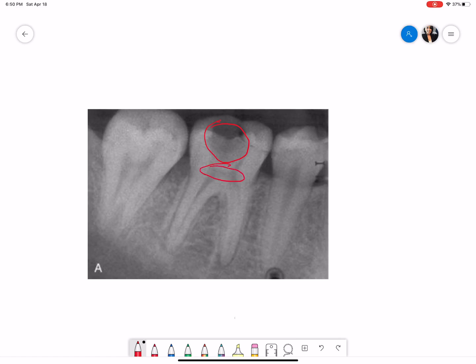The tooth has two roots. The mesial root has two root canals. The distal root has a single canal. The root canals are very much evident without any calcifications.